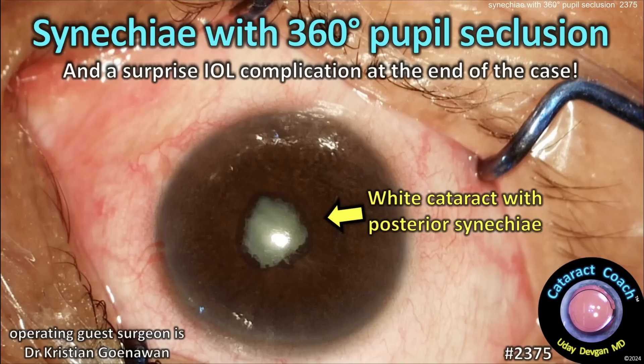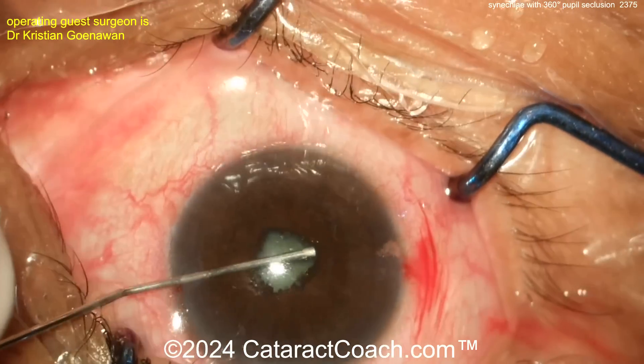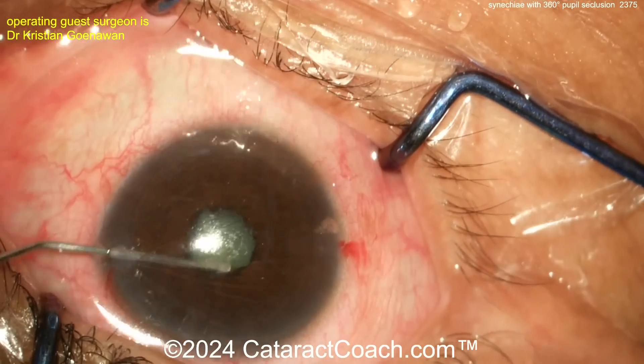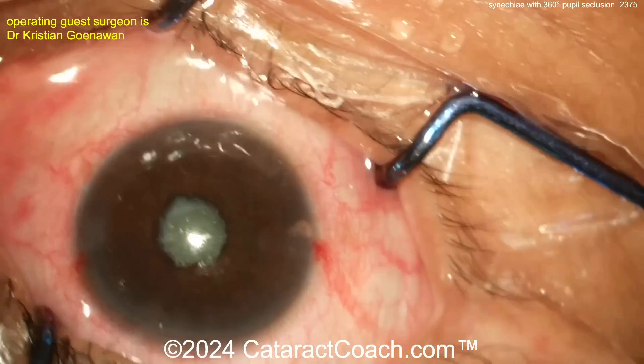This is a cataract case from cataractcoach.com featuring sneaky synechiae with 360 degrees of pupil seclusion and a surprise IOL complication at the end. The video is sped up to get through it. You can see sneaky synechiae all around — the iris is glued down to the anterior lens capsule posteriorly as well.